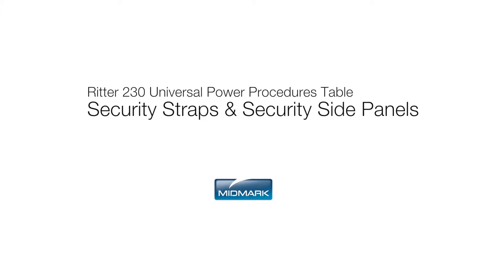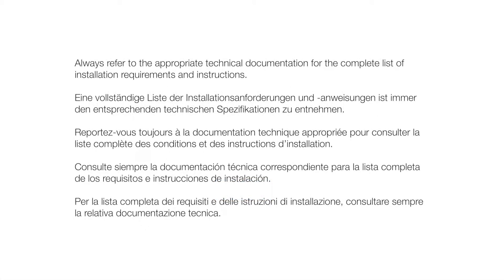This video is an overview of the Security Strap and Security Side Panel Accessories for the Ritter 230 Universal Power Procedures Table. Always refer to the appropriate technical documentation for the complete list of installation requirements and instructions.